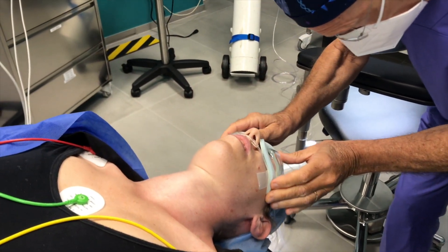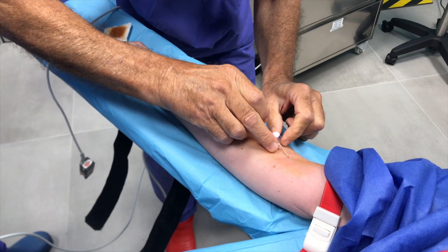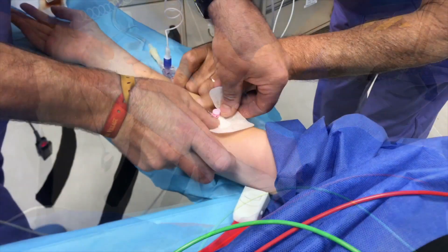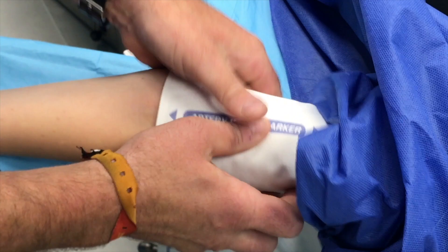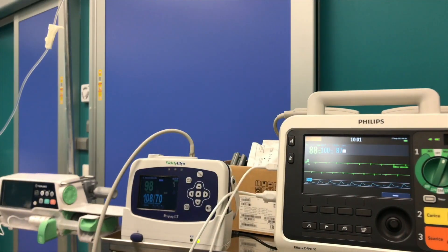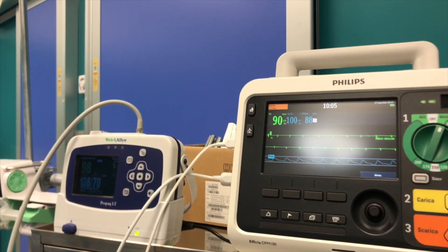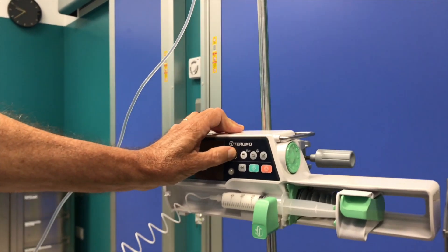Starting from the setup: it is made by the anesthesiologist who takes a forearm vein, takes all vital parameters, puts on the protecting goggles and the nasal oxygen cannula. And thereafter, a sterile field is made. This is very important — because since I did more than 1,800 procedures, I didn't have any single infection.